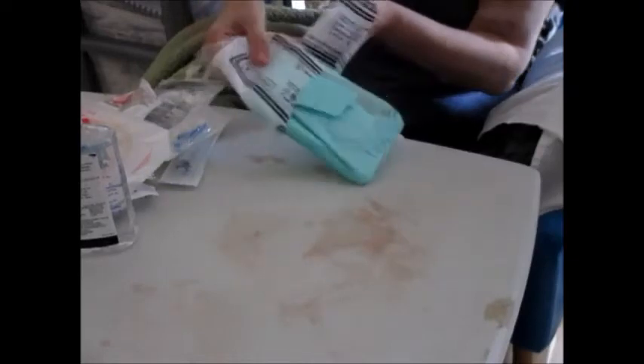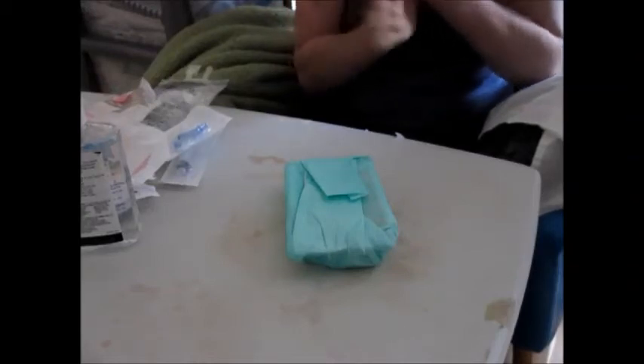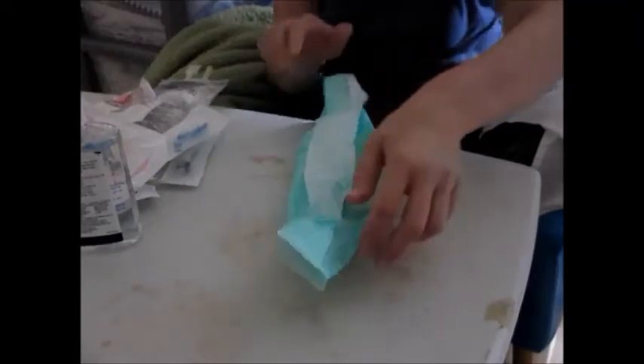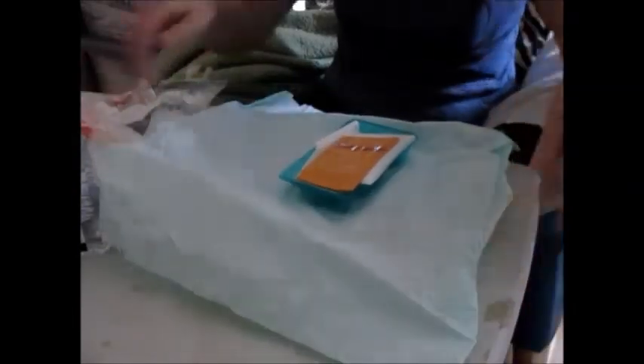Now I'm going to open my pack. I pop it on the table without touching it before putting hand gel on my hands again, because the pack's inner side is sterile. When I open the pack, you'll notice I'm not putting my fingers inside the pack and touching the sterile field inside. I'm just picking up the bag now.